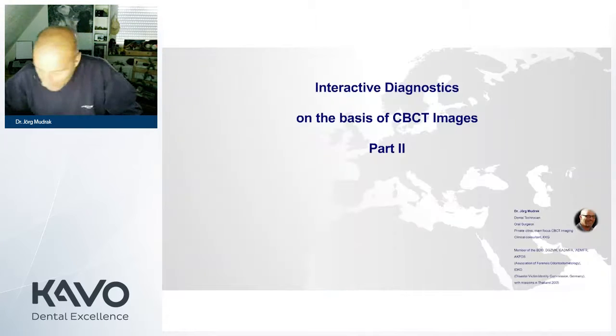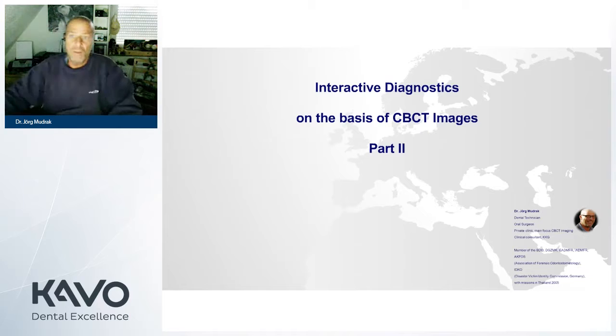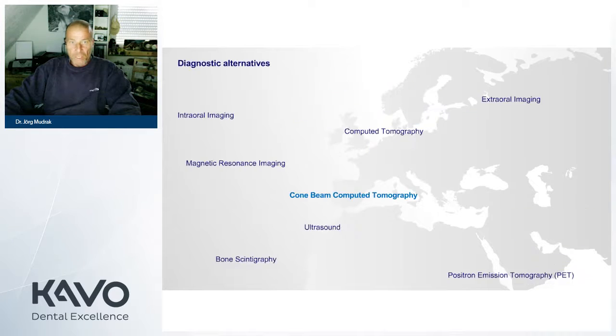So, dear colleagues, ladies and gentlemen, welcome back, or hello from my side. Thank you for joining this second interactive webinar, and we will directly start by showing a brief introduction of what diagnostic alternatives we have in our day-to-day business in analyzing patient data. First of all, of course, we have the intraoral imaging, computed tomography, which is more or less the additional method to gain more information.